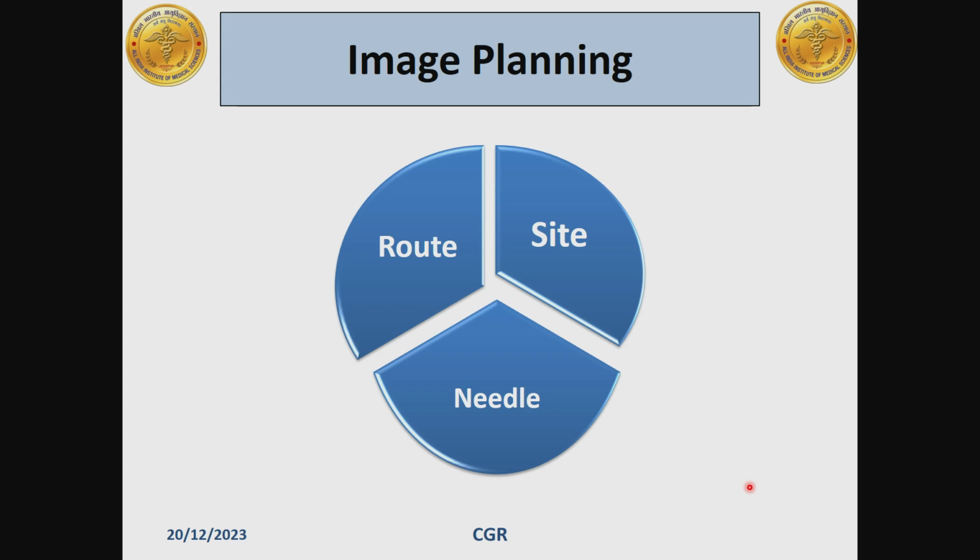In the image planning, as I mentioned before, the route or the trajectory of the biopsy needle is planned, followed by the site, that is, the entry point on the skin, and the type of gauge of the needle which has to be used is confirmed.